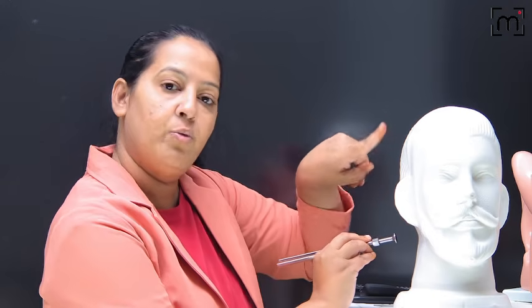Okay, so let's take the three conditions one by one. Normally the patient hears for 10 seconds, and I am hearing for 10 seconds. So the patient and examiner durations are the same, which means it is normal. The patient doesn't have any deafness, the subject doesn't have any deafness. Got it? That is the first criterion. The second criterion: the patient has sensorineural deafness. If my patient has sensorineural deafness, I am activating it, keeping it here, and the patient hears for only 5 seconds.